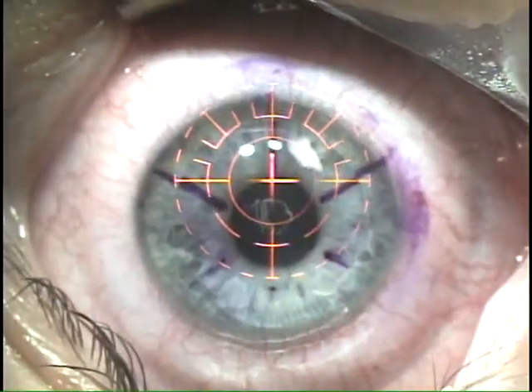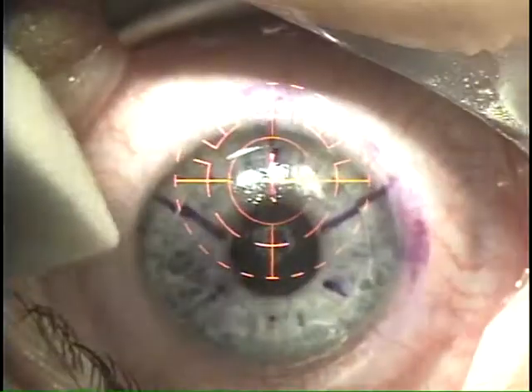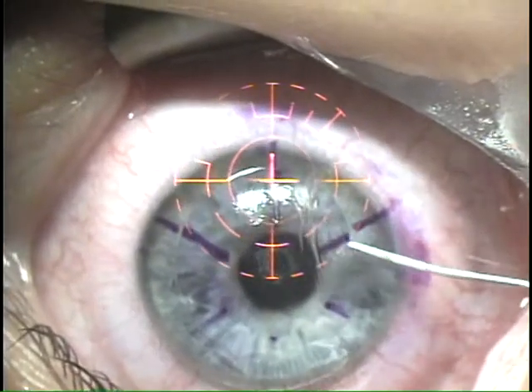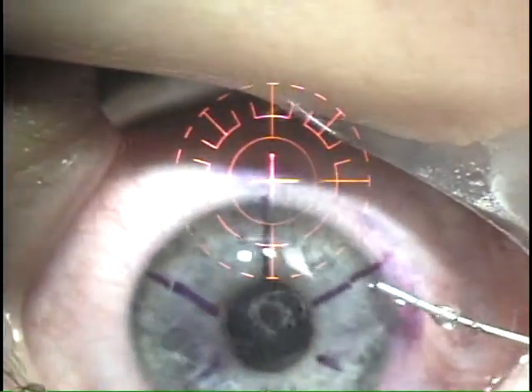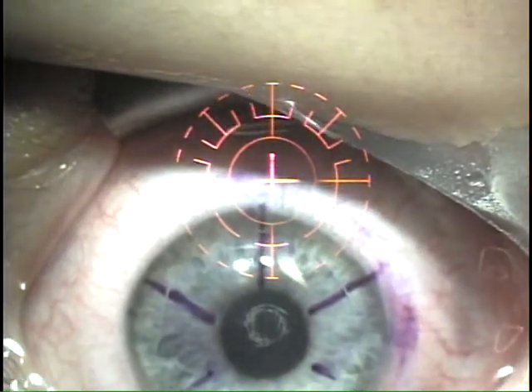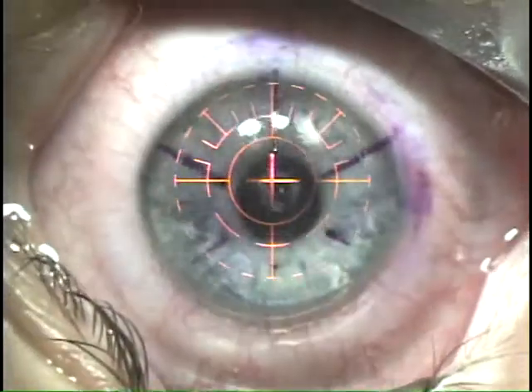Take off this. And that's when I did that — I moved that, see how it's centered there. Very good. That's the way it goes. I'm going to tell you, that's better there. It's right on the center of the marks. I don't know if that corner is perfect where I want it to be.